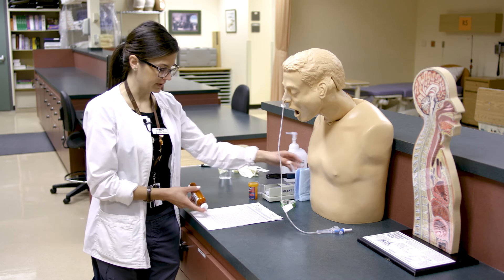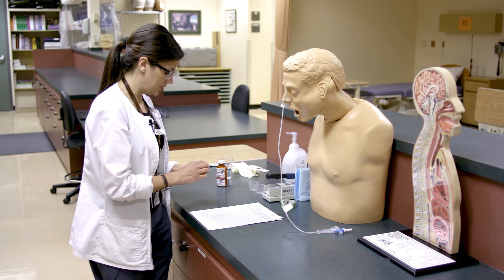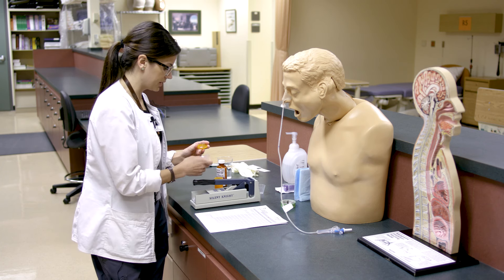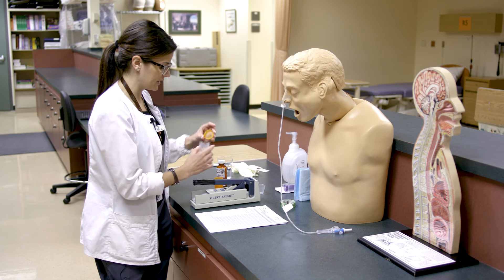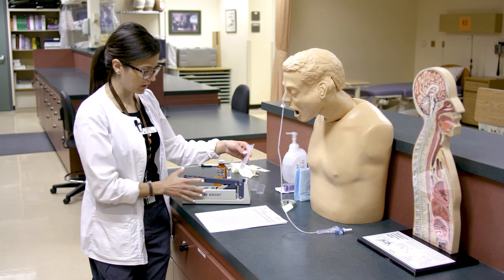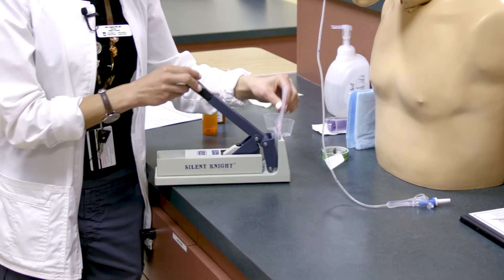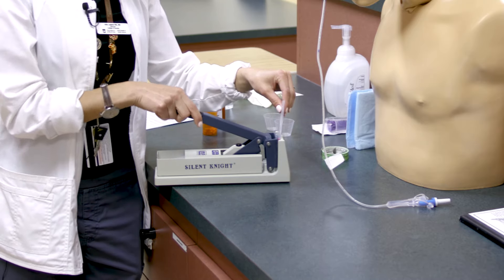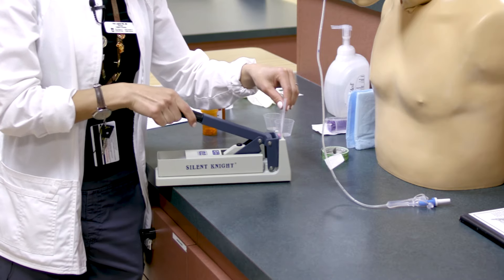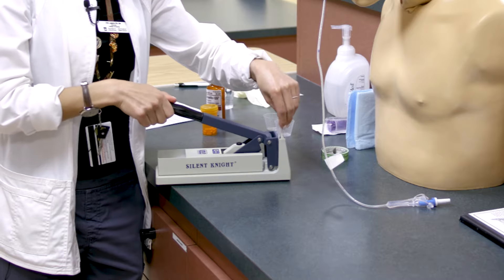We'll start with our Benadryl — we just need one tablet. It's helpful to put it into the cap. We've washed our hands before starting, so if we do need to touch the tablet, we touch it as little as possible. This is the Silent Knight, probably the most common pill crusher. You put the pill in the baggie and place it behind the pulverizer. It helps to gently crush it first — if you just press hard you'll create an indent in the bag and the pill remnants get stuck. Angle it and move the pill around while crushing for a more even result.